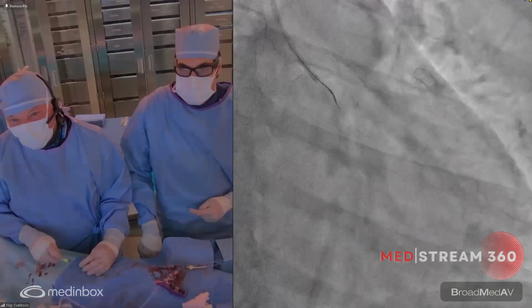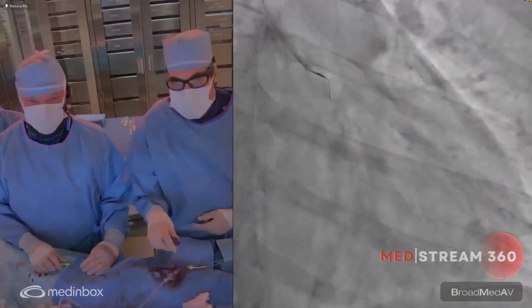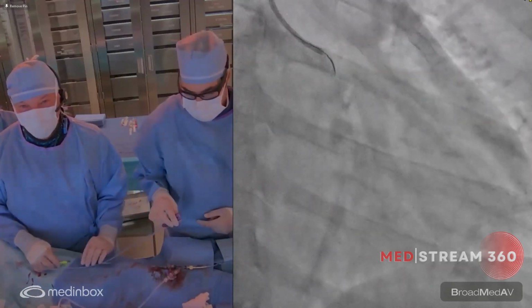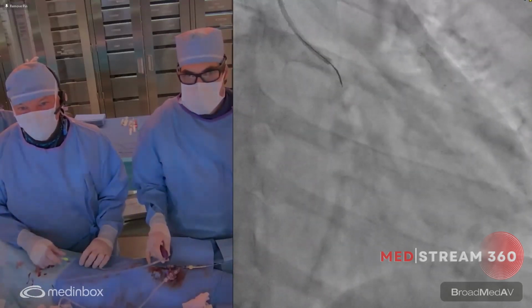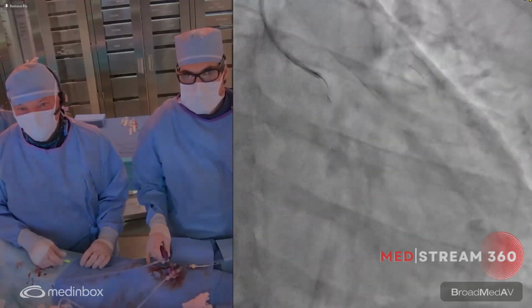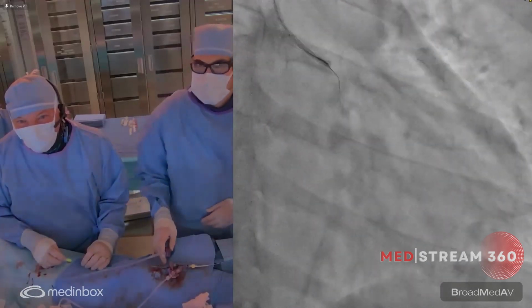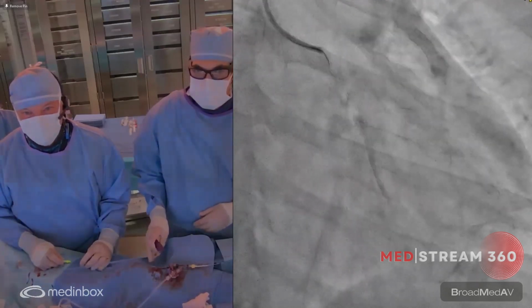I think the take home also is that Kawasaki disease brings a complex calcified occlusion aneurysm that makes it more difficult to recanalize. We've sometimes used laser in some very resistant lesions in Kawasaki disease because they're calcified. We thought about using intravascular lithotripsy, but in this case now we will focus on getting the wire across and see after that. Try to open with a small balloon and then go slowly, to avoid rupturing the vessel.